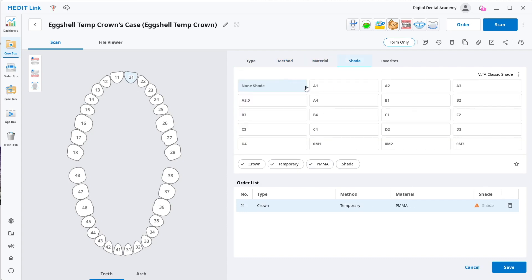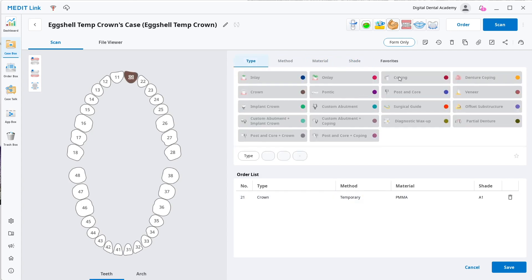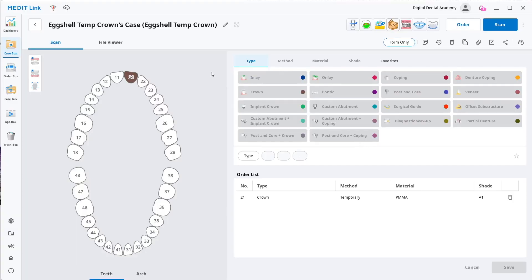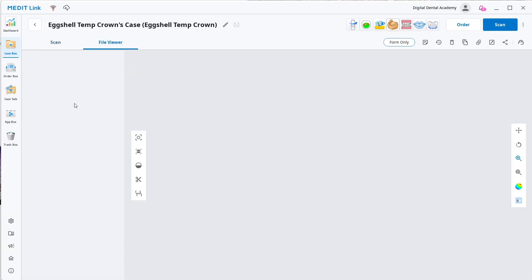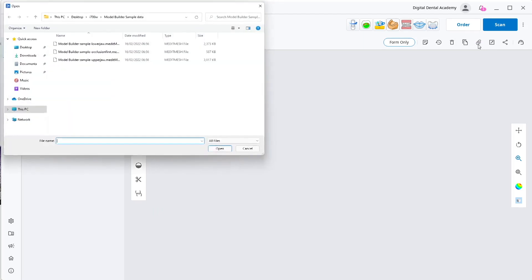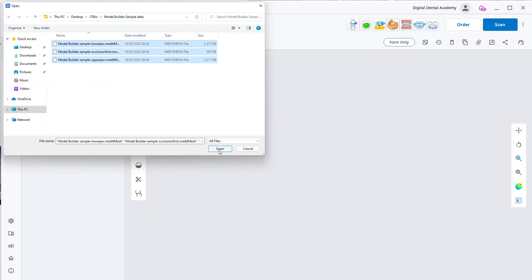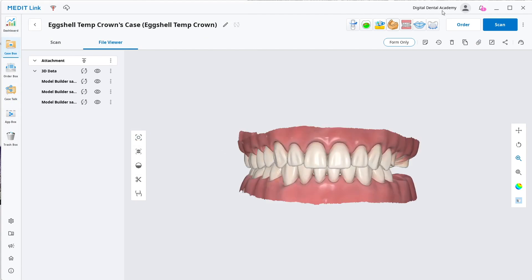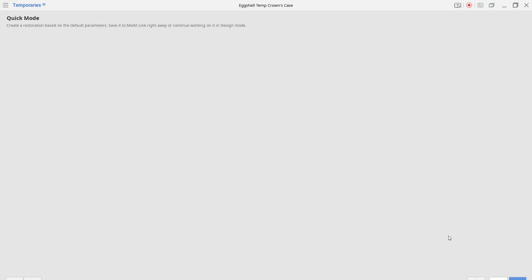So I'm going to select the 2-1, we're going to make an eggshell crown, and I'm just going to select temporary tooth — whatever shade doesn't really matter. Then we can click this, but you'll see it says the problem can only be used when there's an arch scan. We haven't scanned a tooth, we haven't got anything here in the file. So I'm going to show you we can bring in via the attachments and select those models from whatever scanner you have — just bring them in. Obviously if you've got the Medit scanner then you can click the scan button to bring those in first.